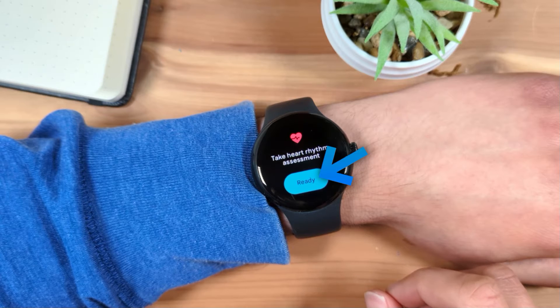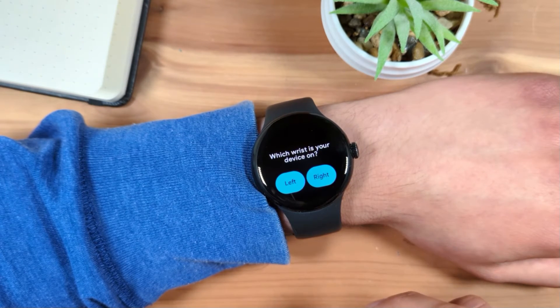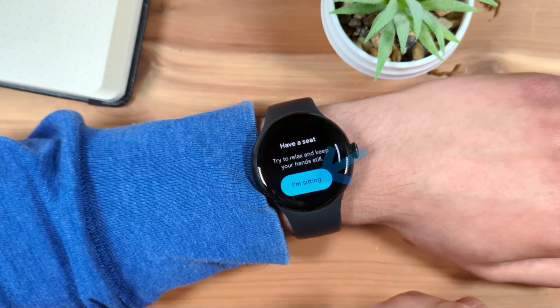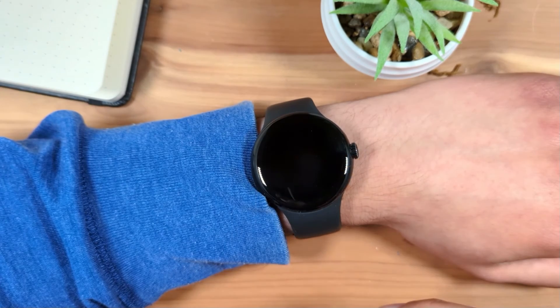Tap Ready. Then enter if the watch is on your left or right wrist. You'll need to be sitting, relaxed, and still to take your ECG. Tap 'I'm sitting' when you're ready.